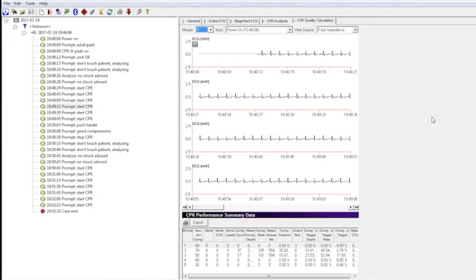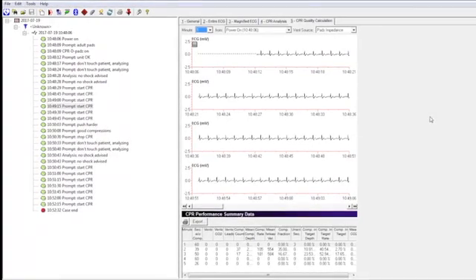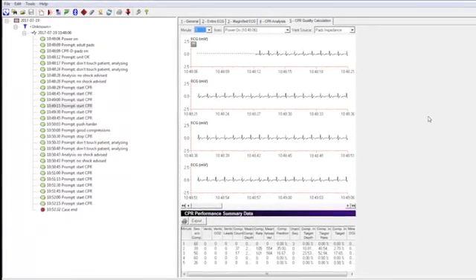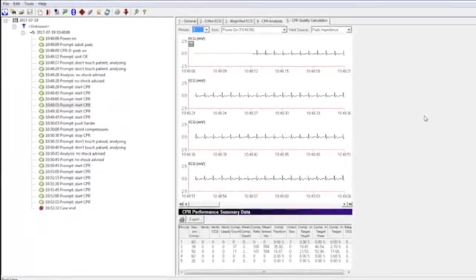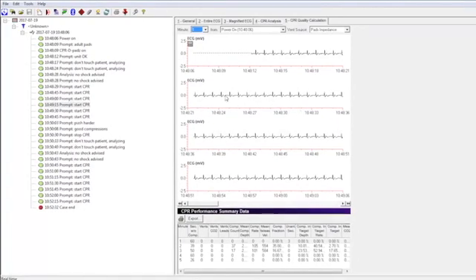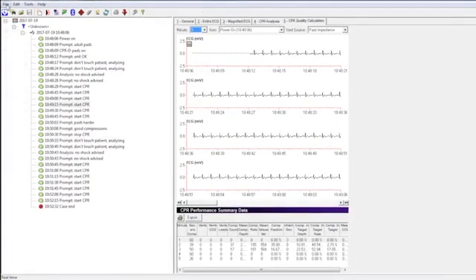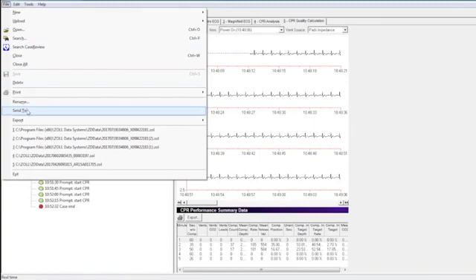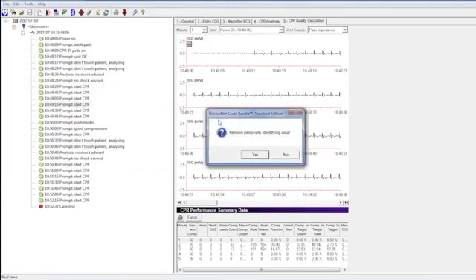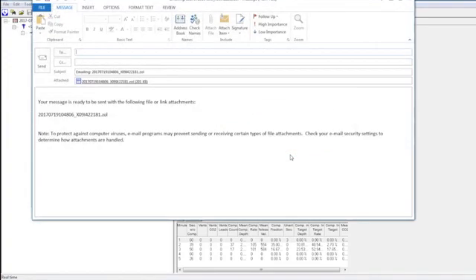Should you be requested to provide case data to medical professionals or to a medical director, you can email it to them as a file attachment. Simply select File from the top left of the toolbar, select Send to Mail Recipient. It will open a mail folder with the case file attached in your default email application.